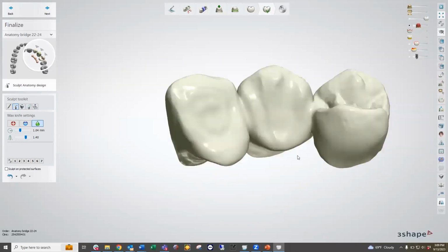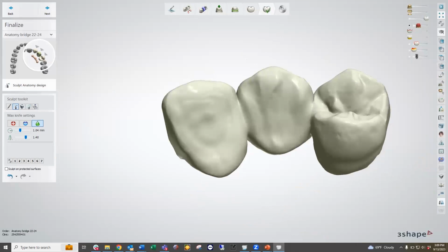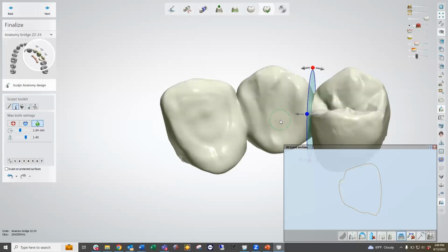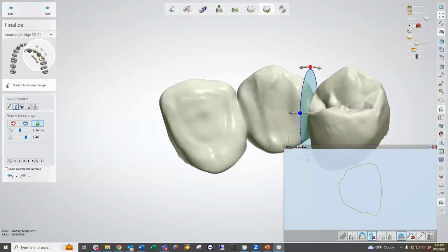Finally, with all bridges, we need to check that the connection between units is going to be satisfactory as far as minimum thickness goes. So I'm going to use the 2D cross-section tool, and this allows us to measure the area of that to ensure that we have a nice thickness. With full contour, we're looking at about 12 millimeters squared for our anteriors, or about 15 millimeters squared for our posteriors. So I'm going to measure this one over here as well, and we can see whether or not we're meeting that minimum thickness.